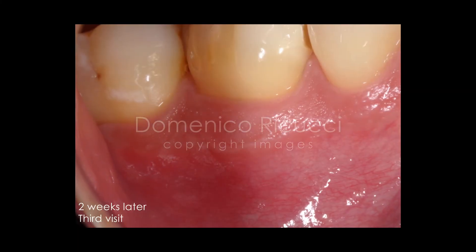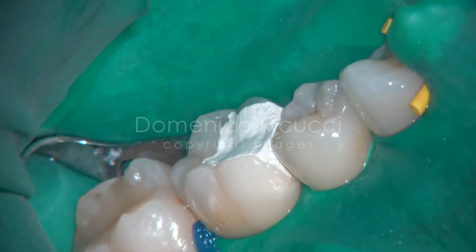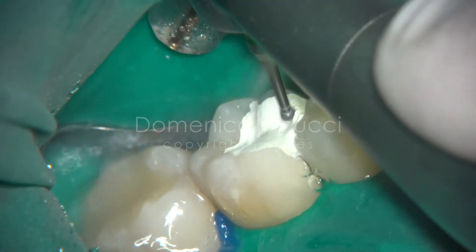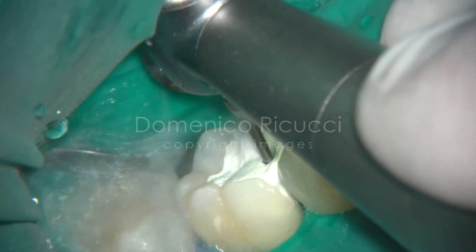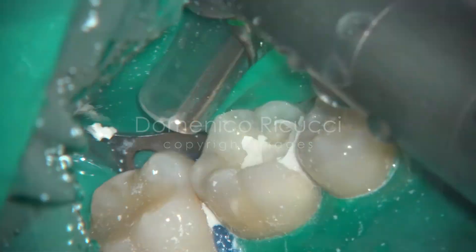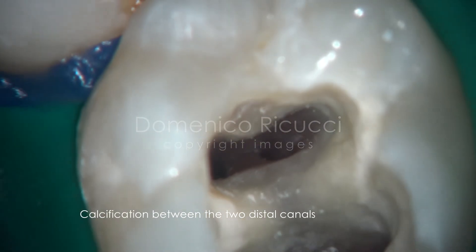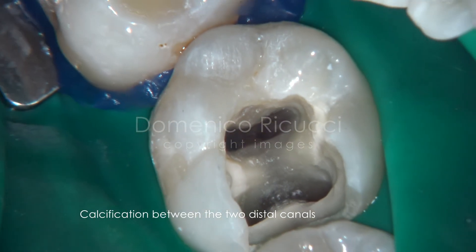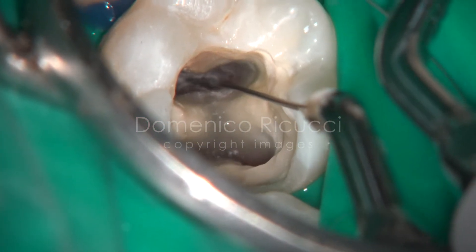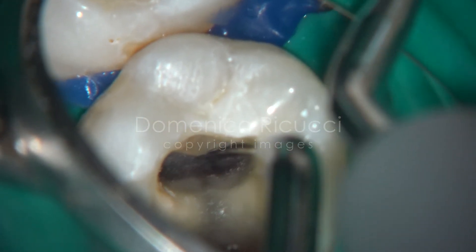Two weeks later, the sinus tract had disappeared and the tooth is comfortable. The temporary IRM material is removed. For improved debridement, it is decided to remove this tissue and unify the distal canals. This is accomplished with a thin ultrasonic tip.